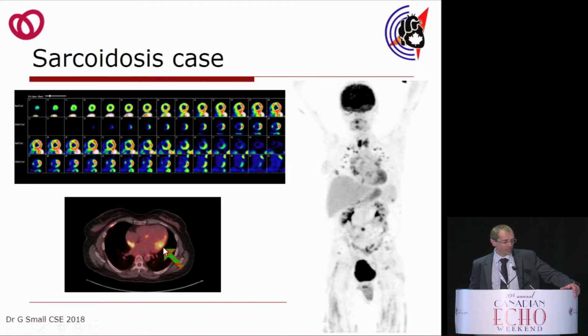And we're able to localize the cardiac uptake to the lateral wall, the basal septum, and the right atrium. This may not, however, be her first run-in with sarcoid, as evidenced by the rubidium perfusion images, which show a moderate reduction in tracer uptake in the apex and throughout the inferior and anterior septum.